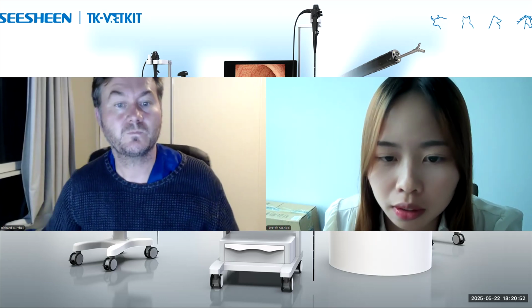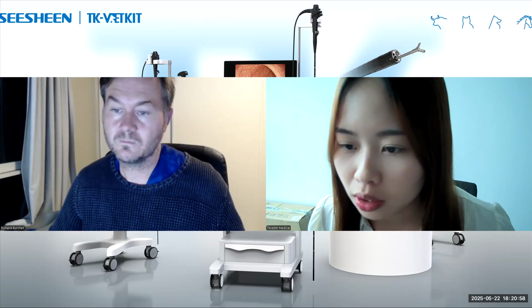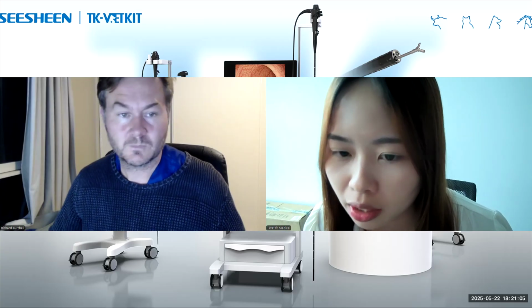Okay. Thank you for your question and your answers. And another question from Mr. Bolt is: is oxygen necessary to see the lung in large animals?